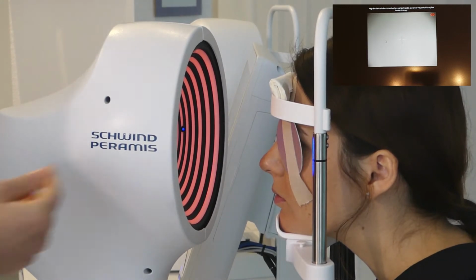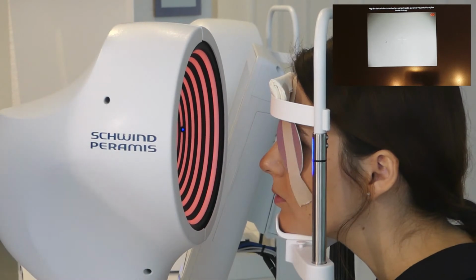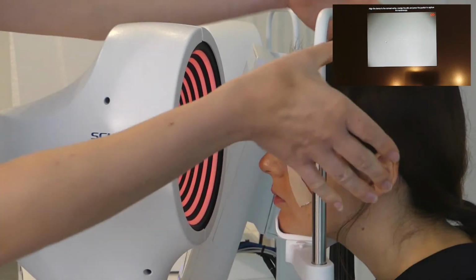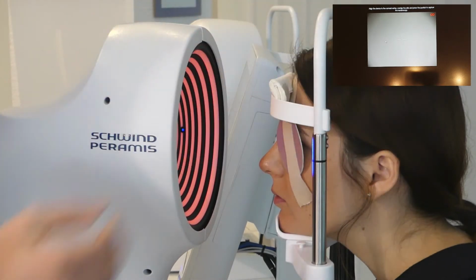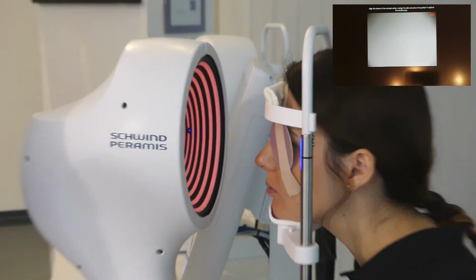Take care that the spacer is not below the forehead rest, otherwise you will create further shadow. You see again also the head I have tilted to the left side because now I'm measuring the right eye. Now my patient is in a very perfect position to start my measurement.